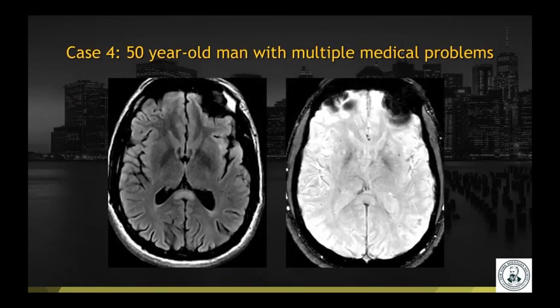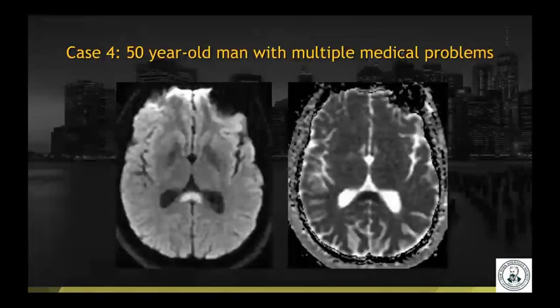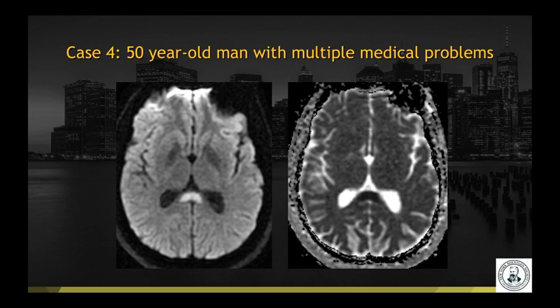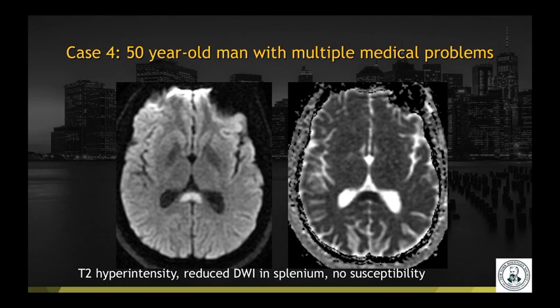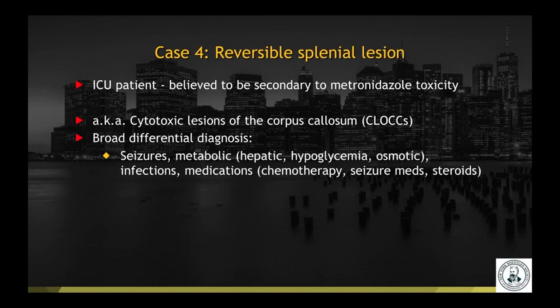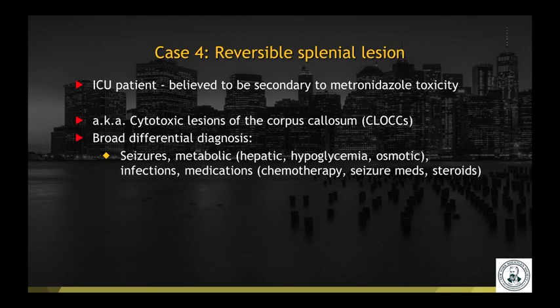Case number four: a 50-year-old man with multiple medical problems. Axial T2 FLAIR, axial susceptibility weighted imaging, axial diffusion, and ADC demonstrate T2 hyperintensity and reduced diffusion in the splenium of the corpus callosum, with no abnormal susceptibility to suggest hemorrhage. This is known as a reversible splenial lesion, or cytotoxic lesion of the corpus callosum. The key thing is to know that there's a broad differential diagnosis — it can be seen with seizures, various metabolic disorders including hepatic encephalopathy, hypoglycemia, osmotic demyelination, certain infections, and medications. This patient was in the ICU, and it is believed to be secondary to metronidazole toxicity.